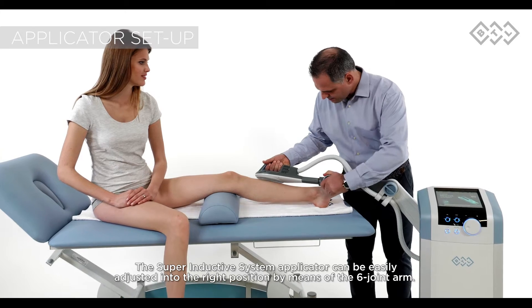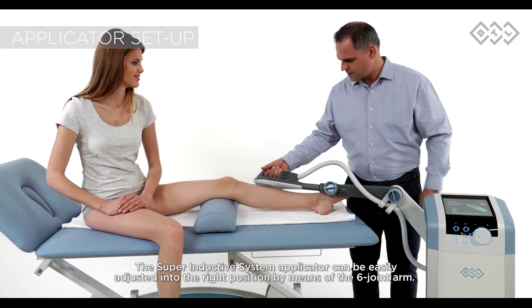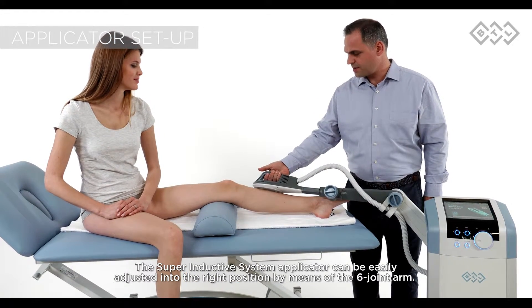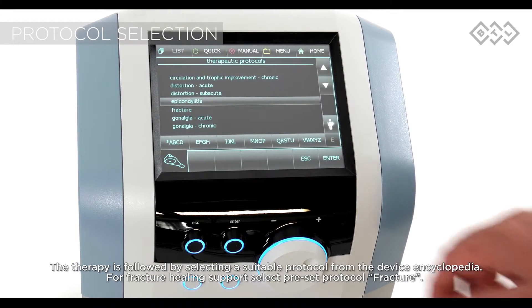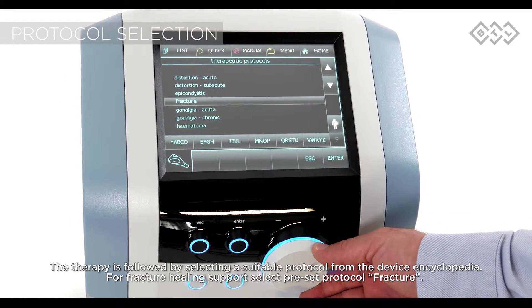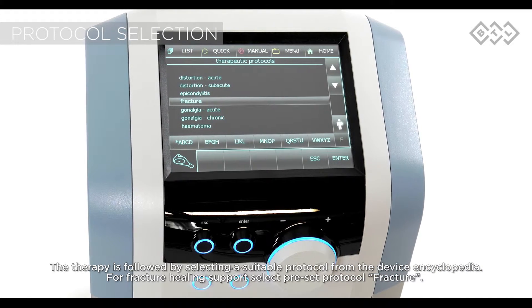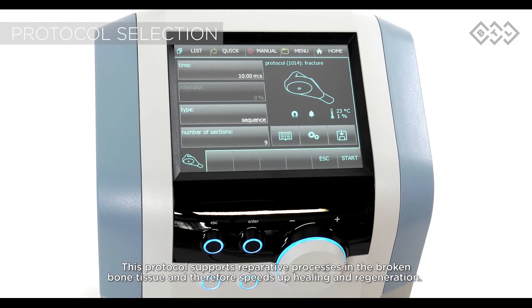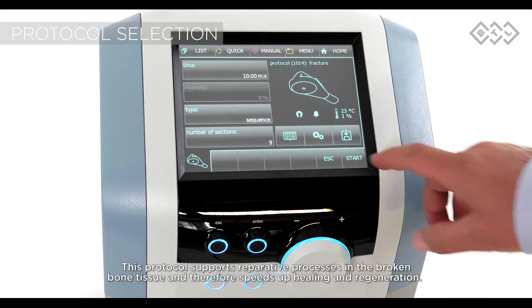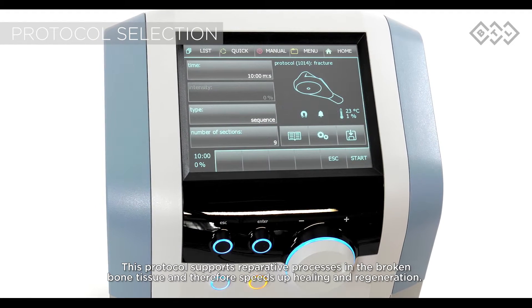The super inductive system applicator can be easily adjusted into the right position by means of the six joint arm. The therapy is followed by selecting a suitable protocol from the device encyclopedia. For fracture healing support, select the pre-set protocol fracture, which supports reparative processes in the broken bone tissue and therefore speeds up healing and regeneration.